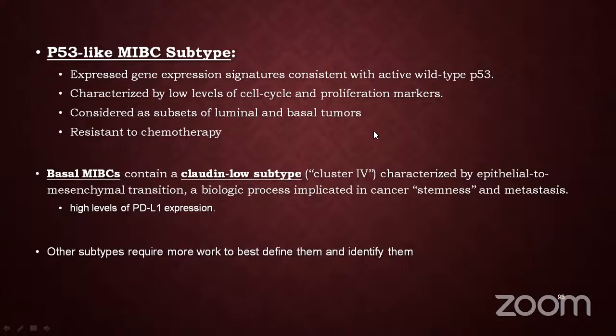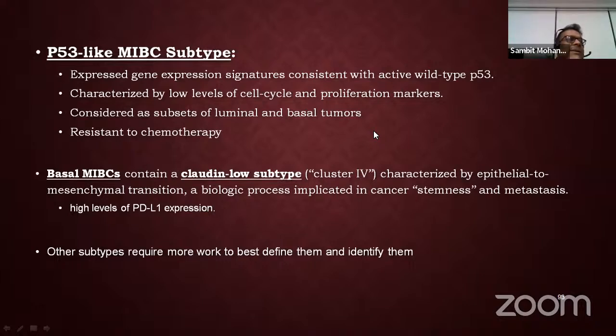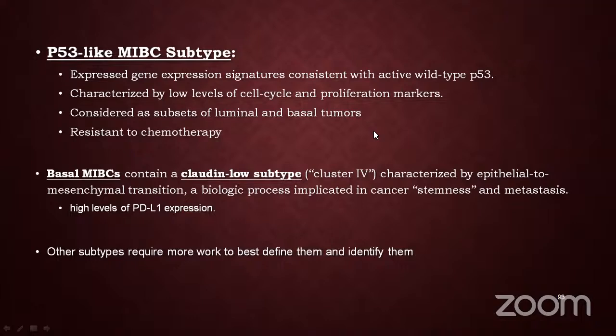Sometimes what happens, the urologist gives a separate deep muscle specimen, but that was not actually deep muscle. It was a part of this high-grade urothelial carcinoma. People do get confused and designate it as deep muscle. But unless you see the detrusor bundle, you should not mention it. You should not write it, because you will be confused and say that deep muscle is being invaded, and they will cut the whole bladder.